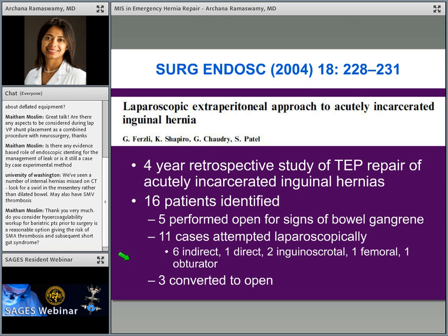Stephen, if you could pull up those videos. These are two short videos. This is a patient who, as you can see, is a little fluffy, who's got an incarcerated hernia there. Came in, had a little bit of skin changes, had a good amount of tenderness, a white count, if I recall, of about 16, a diabetic with hypertension. But there was nothing systemic that concerned me about this patient, so we decided to go ahead laparoscopically.